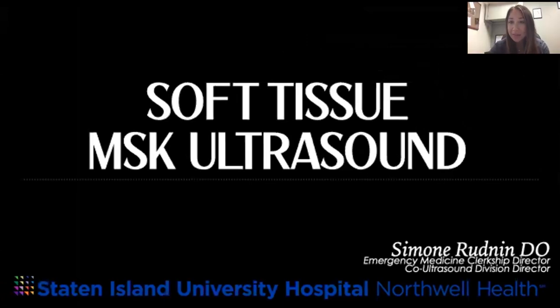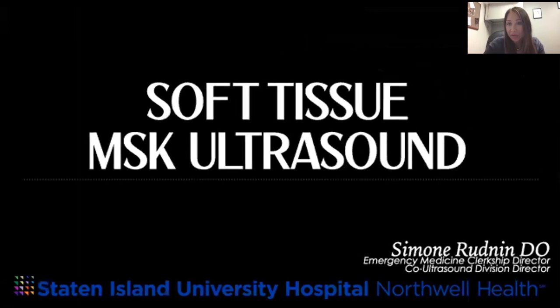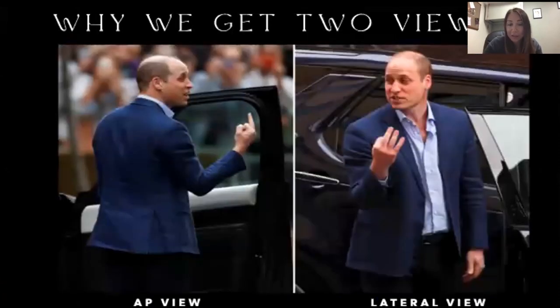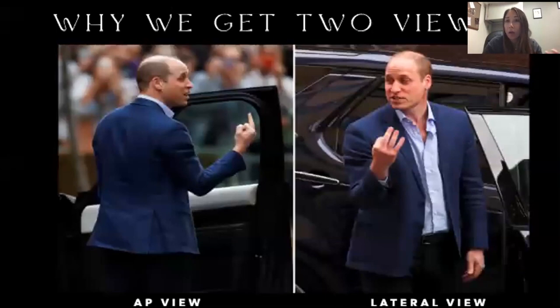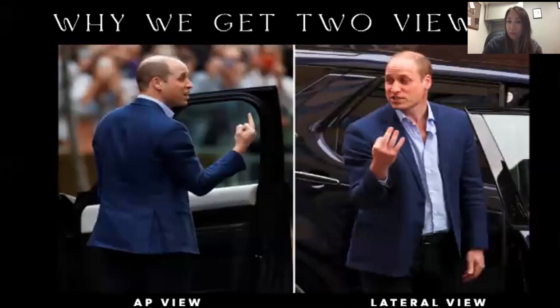So today we're going to be talking about soft tissue and MSK ultrasound. Any time we do a soft tissue or MSK ultrasound, you have to look at things in at least two views, because what you might initially see is not actually there. We want to look at both sagittal and transverse planes.